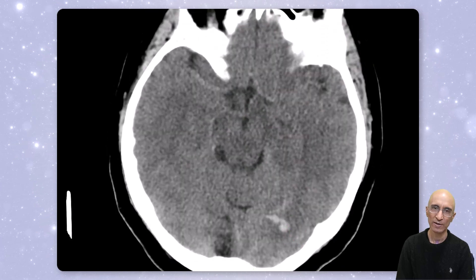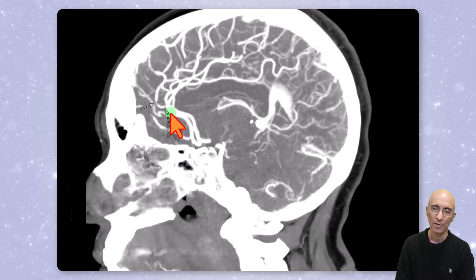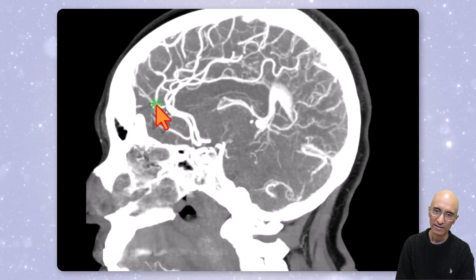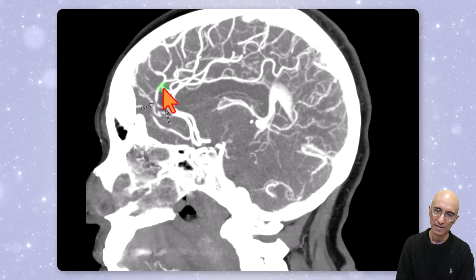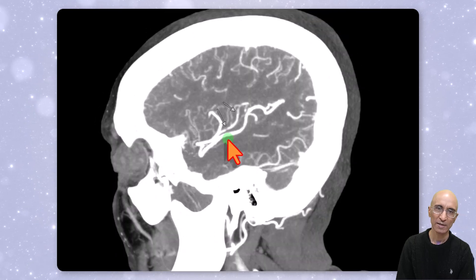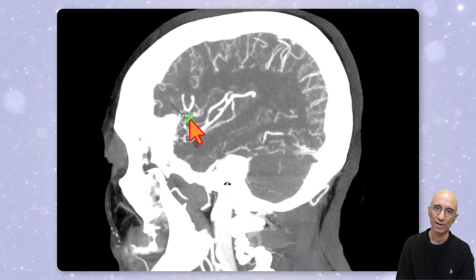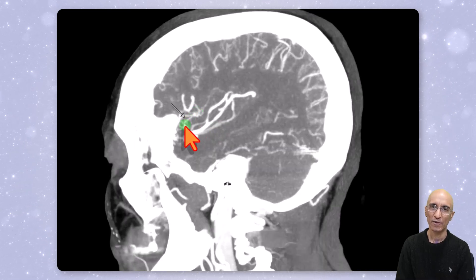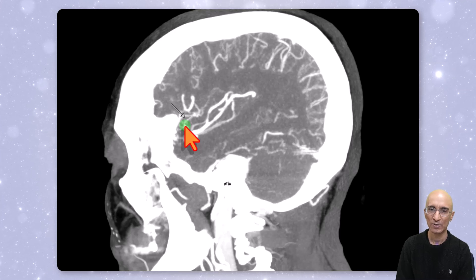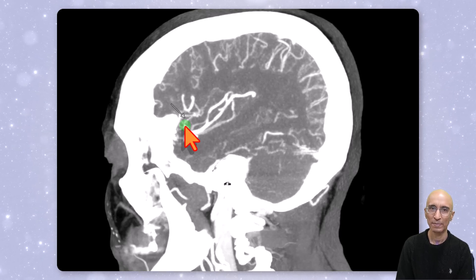The patient also underwent a repeat CT angiogram examination. On the repeat CT angiogram, we can clearly see regions of vasospasm in the anterior cerebral artery and middle cerebral arteries, which were not seen on the initial CT angiogram. These findings are concerning for reversible cerebral vasoconstriction syndrome (RCVS) in the setting of hypertension.